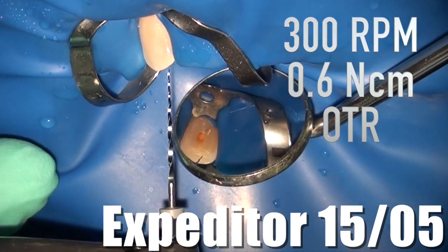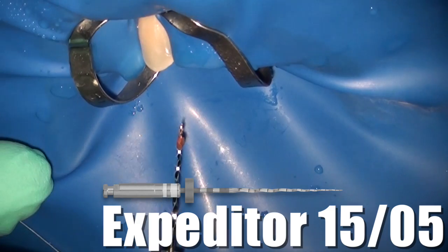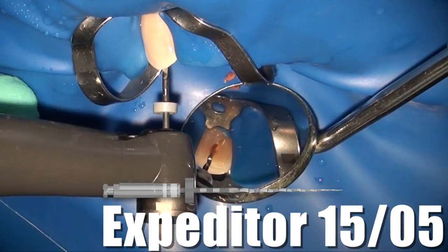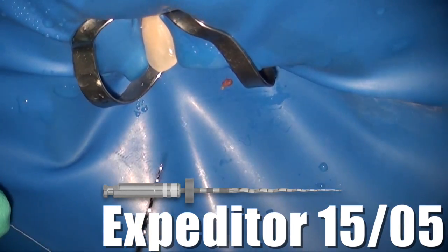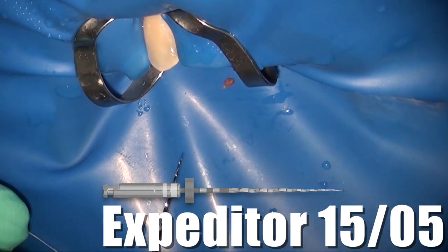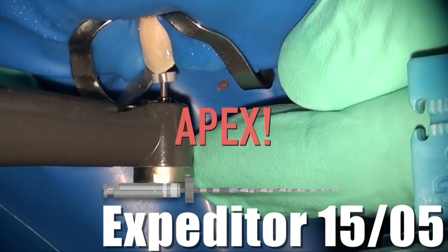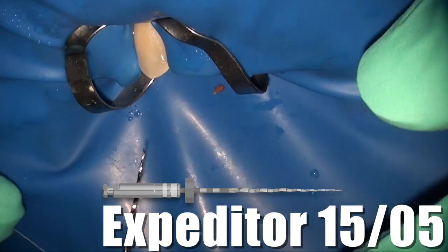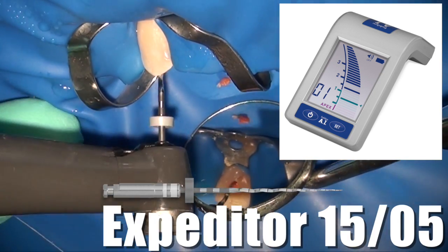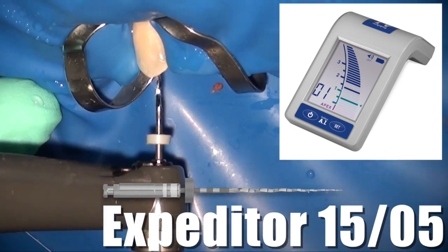We put the expediter in the Endosync handpiece, connect it to the Endosync AI, and set it to 300 RPM with an OTR setting of 0.6. We take a few strokes using single stroke and clean, working our way down using the EndoSwipe and cleaning debris after each stroke to engagement, trying to stay below OTR engagement if possible. After just a few strokes, we have reached the apex — the Endosync AI signals that we've reached the apex, the file stops, and we adjust the stopper.